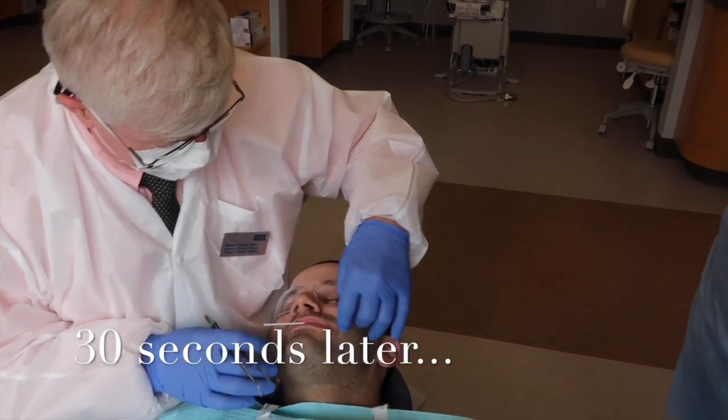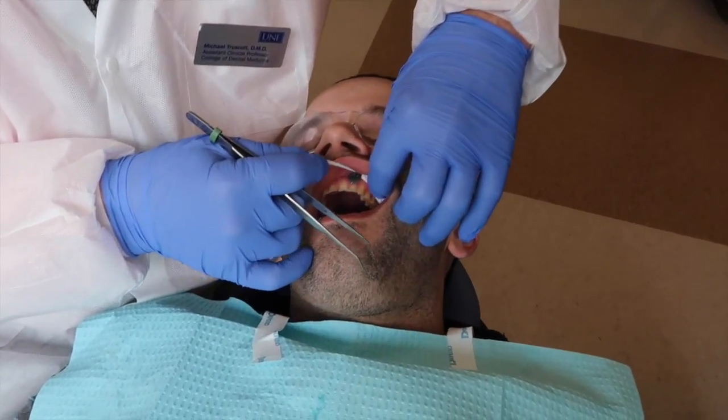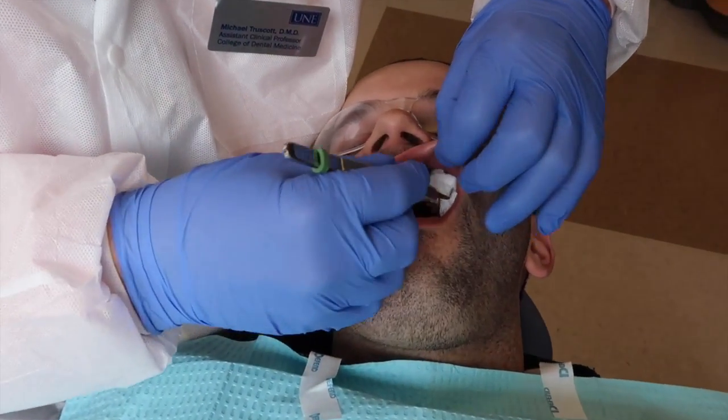Hold for 30 seconds. Open please. Leave the carpule where it is, take the Q-tip out, and then remove all the extra.